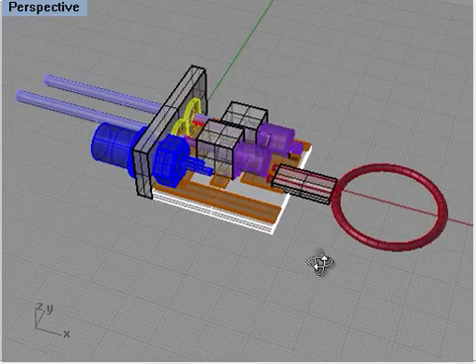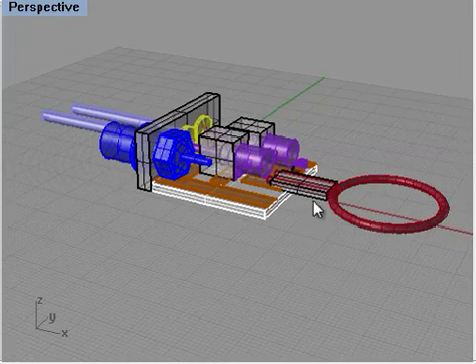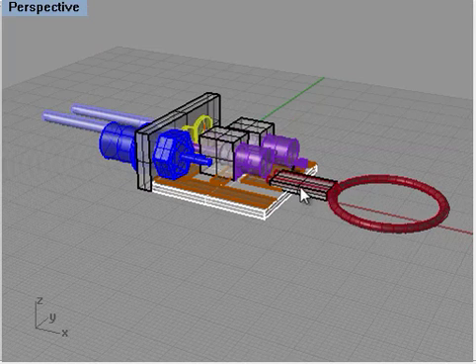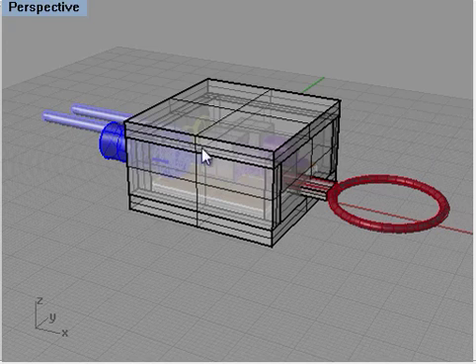Some other little nuances about this design. You can see here these legs are designed to extend the coil part of this circuit away from the base, because what we want is to have the internals protected. So if I protect them by this plastic box, now I need to have the coil away from that box.